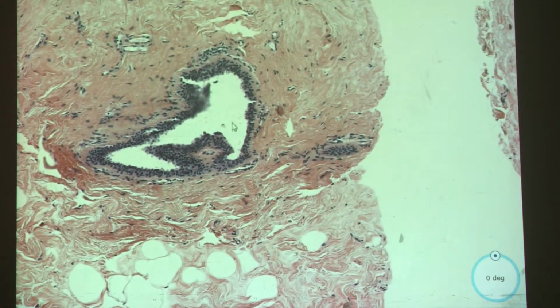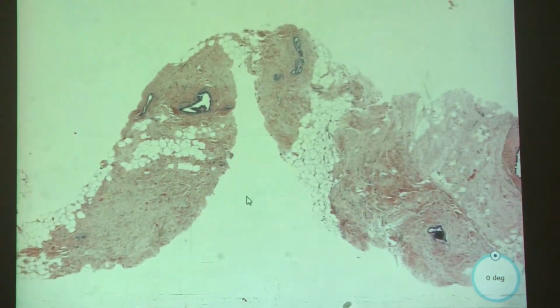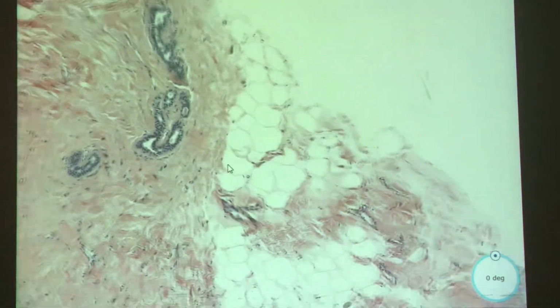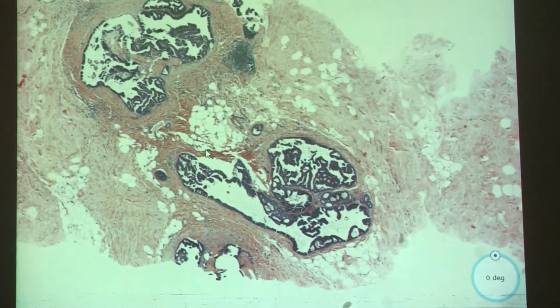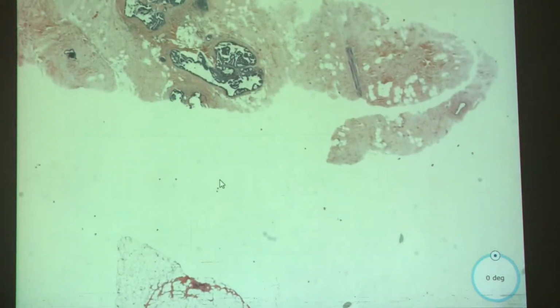This is a more benign area. Yeah, isn't that so cute? Just for comparison. Some ones are more normal here. Yeah. So that, and this weird bloated thing. Alright. Okay, I think there's nothing else.